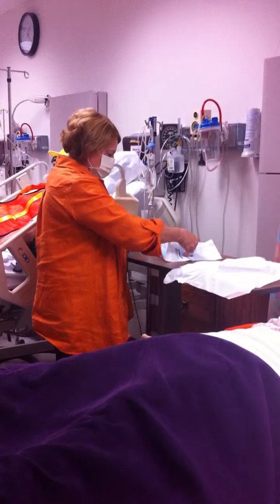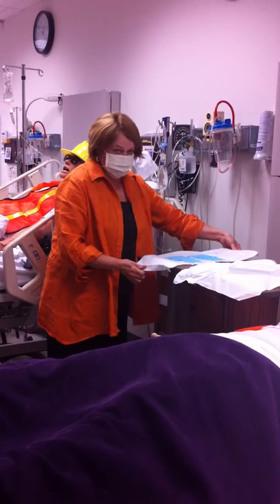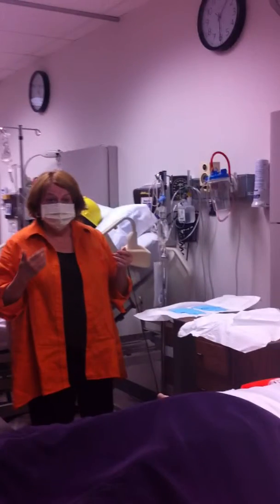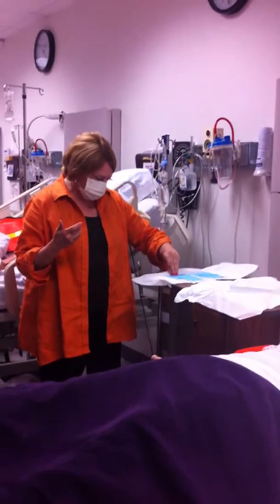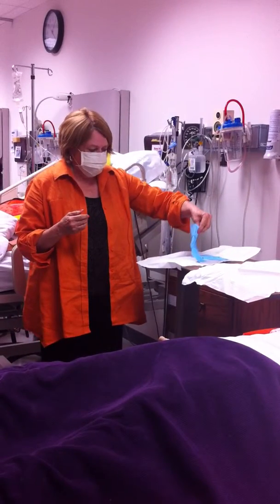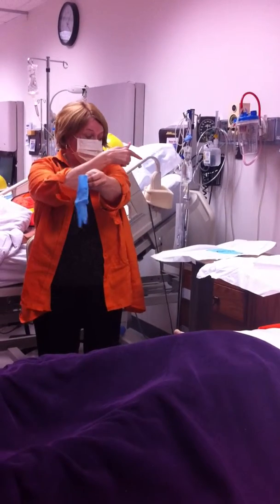You're going to glove your dominant hand first. If you're right-handed, that means you glove the right hand. Left-handed, glove the left hand. So, pick this up. I'm going to hold it well above my waist and away from the other sterile glove.